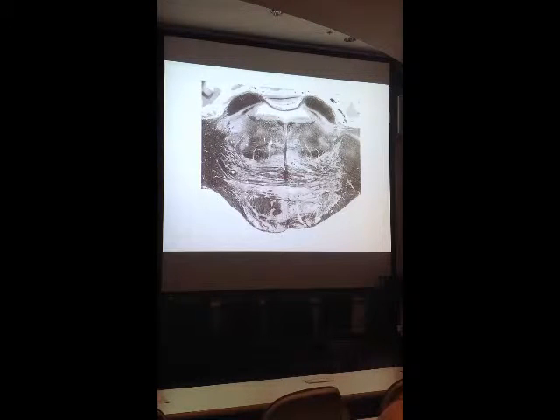Remember, these pontocerebellar neurons originate from pontine nuclei. So most all these gray matter areas between the fibers are pontine nuclei. Again, the pyramidal fibers are going through the basilar pons in fascicle-like bundles, so that fits with being pons. So here are the pyramidal fibers. Again, there are other descending motor control fibers mixed in here as well.